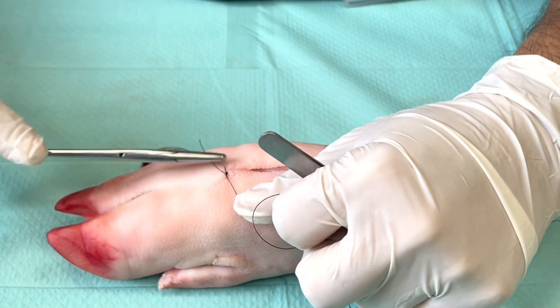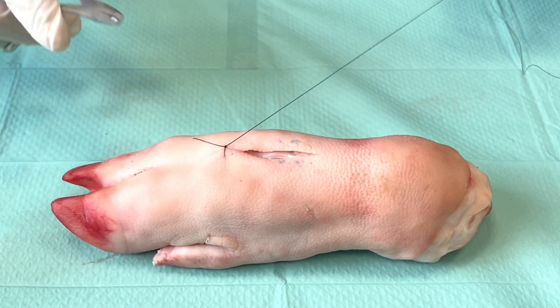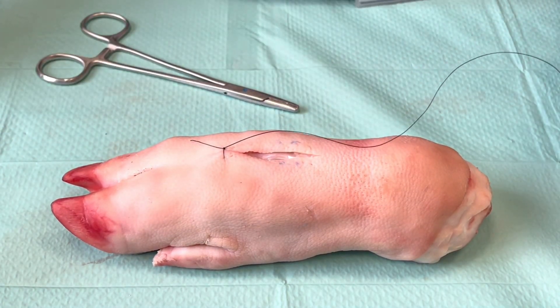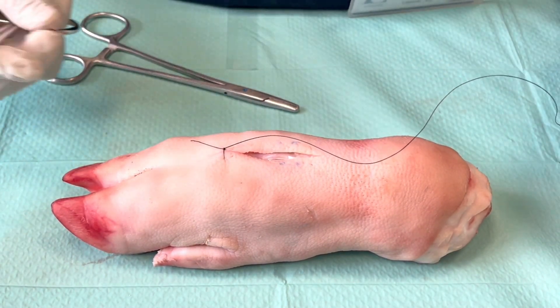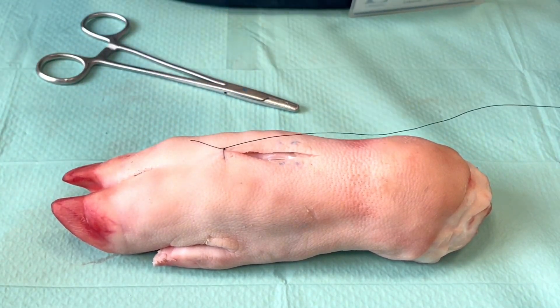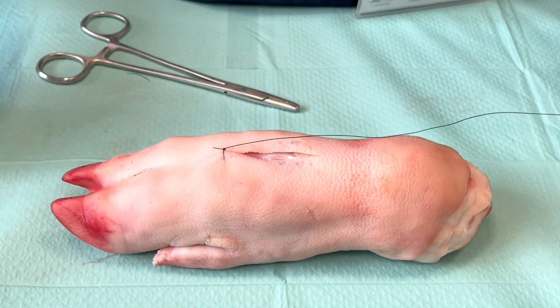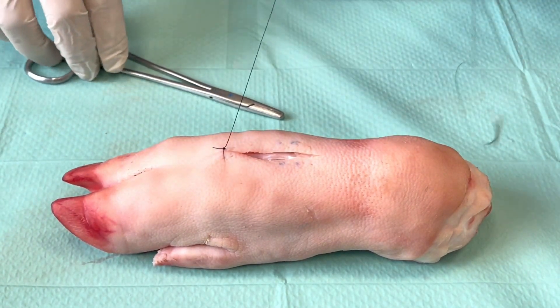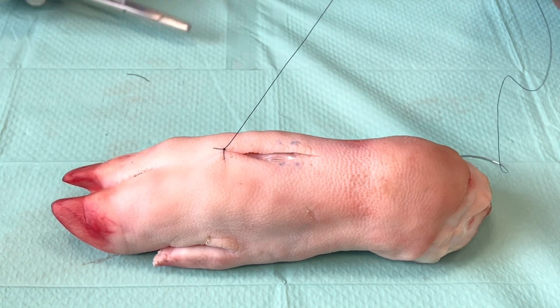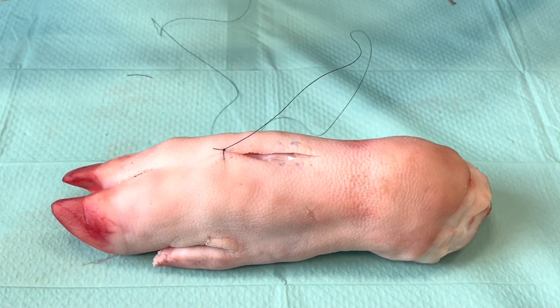You need to bring your knot towards you, and this will help you continue your suture. Once you have done this, here is the place where there's a difference between a simple interrupted and a simple running stitch. In a simple interrupted stitch we would cut off both ends, but for a continuous suture we only cut the short end and then use the remainder of the suture to run over the wound and close it.